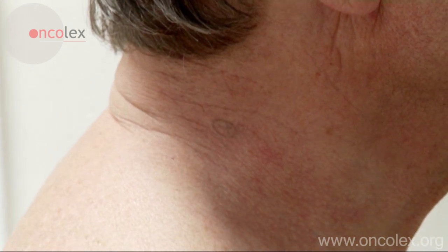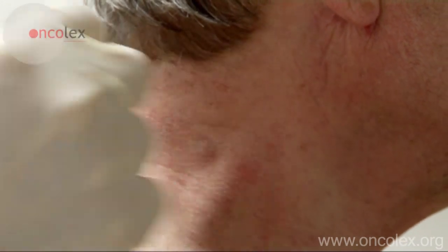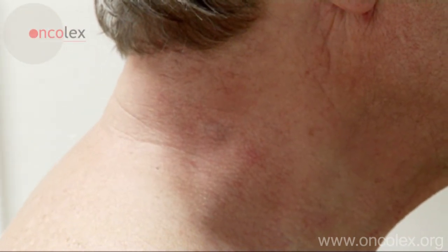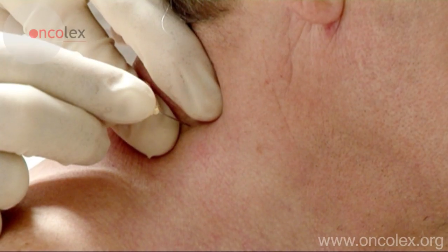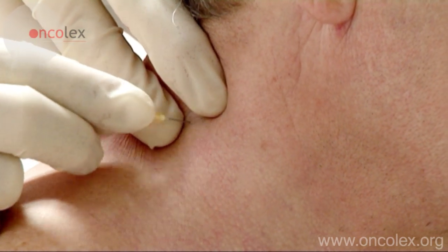This is a video of a fine needle biopsy from a lymph node on a patient's neck. The skin is disinfected with 1 mg per milliliter chlorhexidine. The lymph node is located and the optimal position for the needle is found.